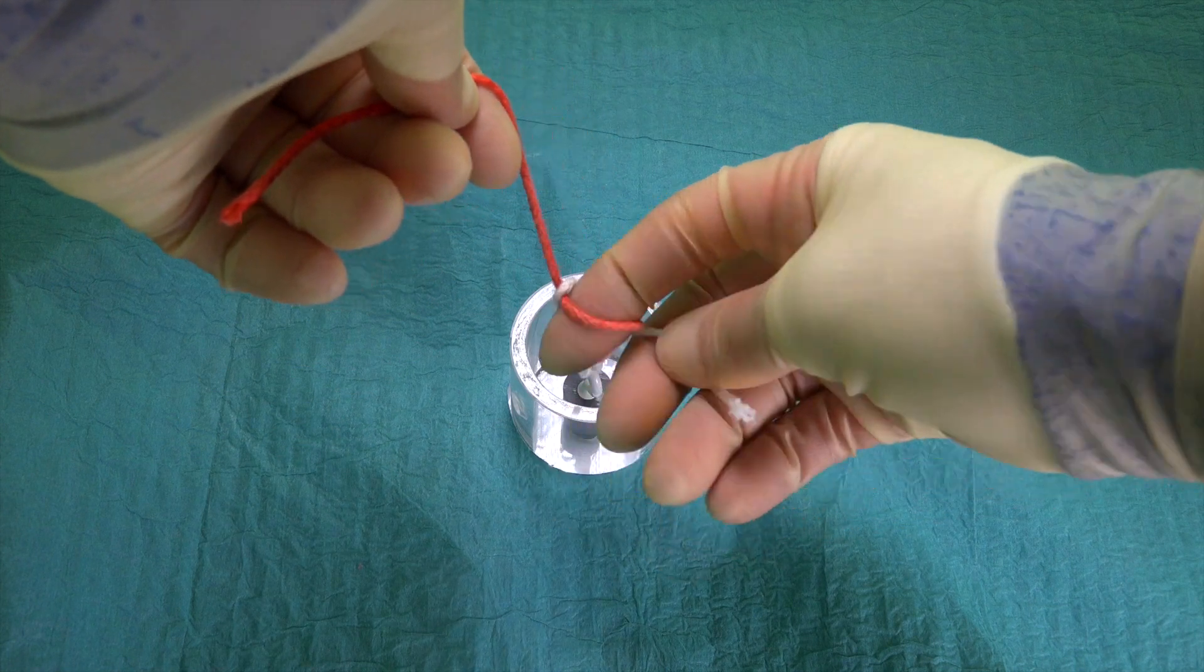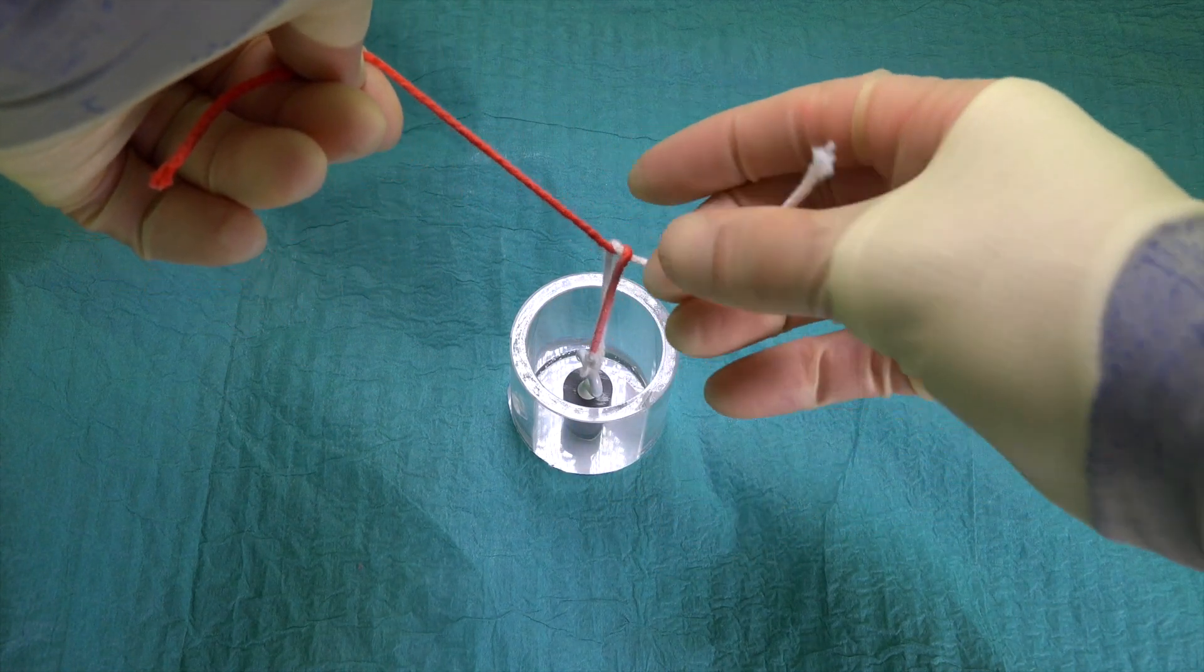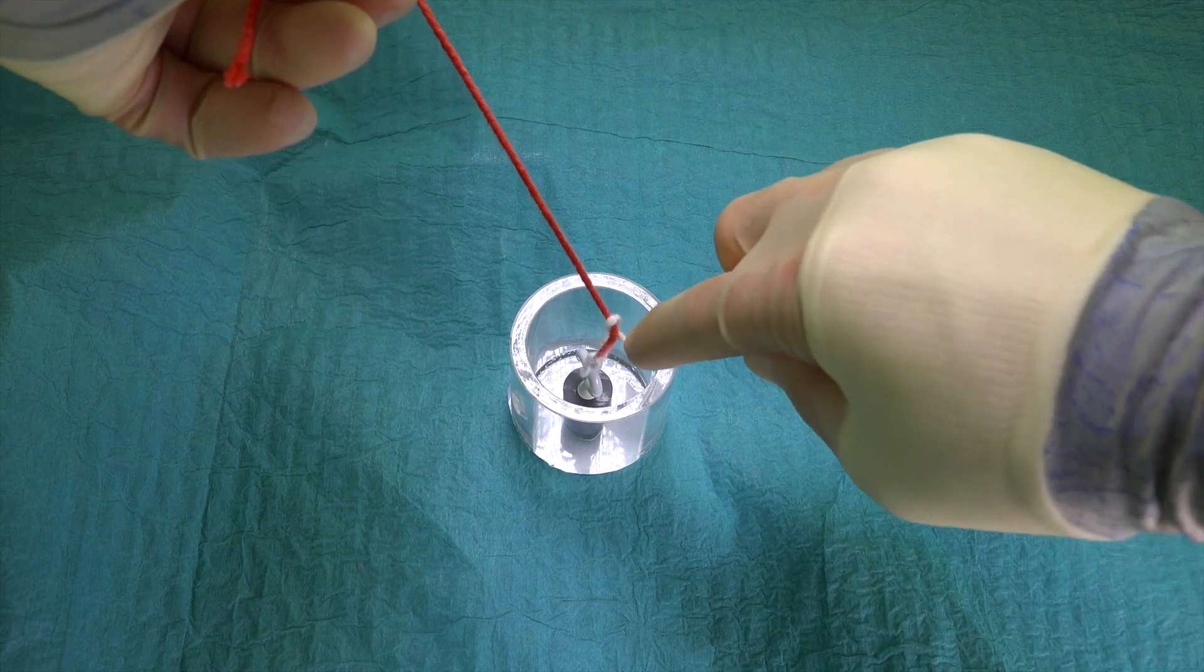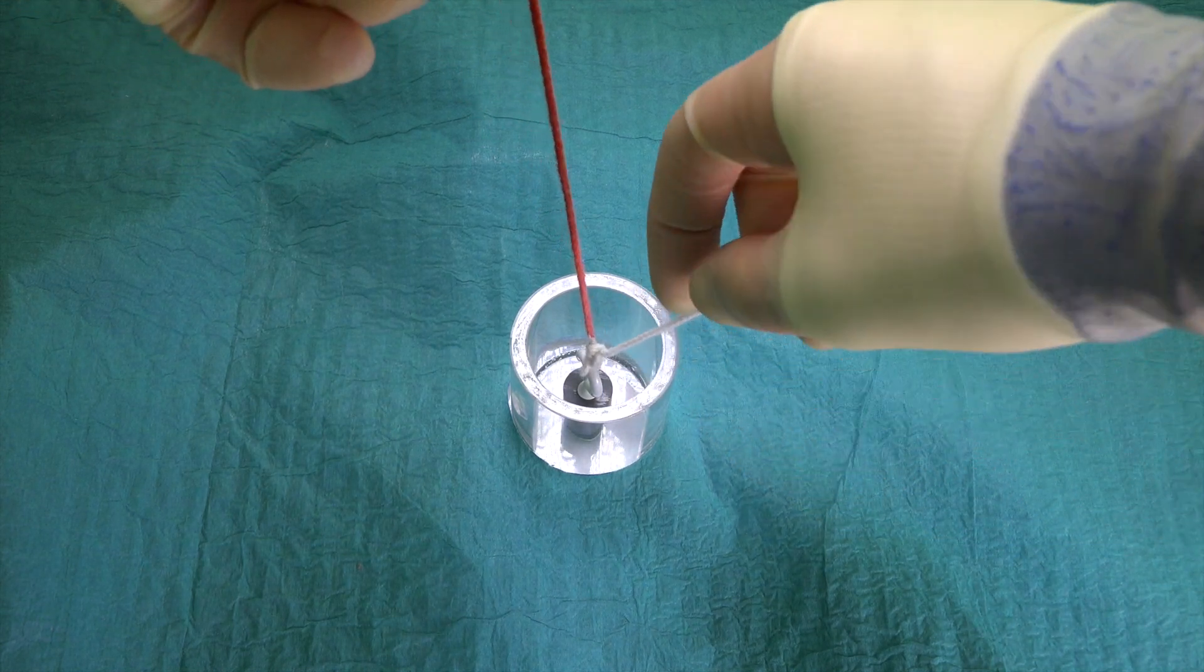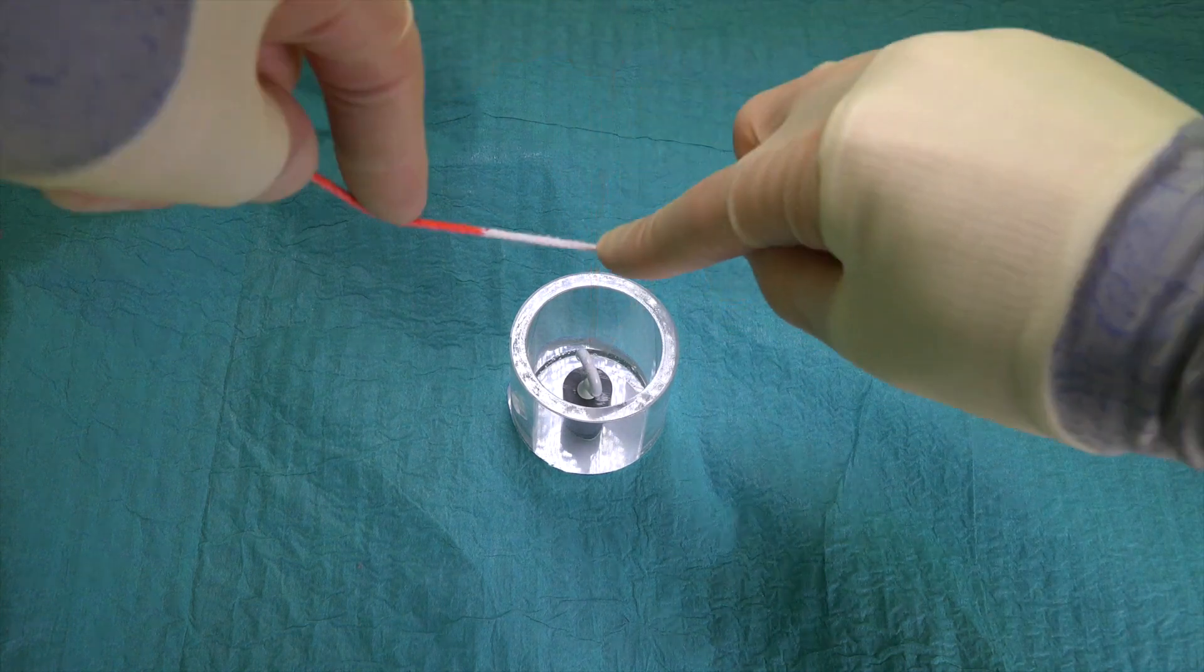Again, we should note that the hands do cross, albeit to a lesser extent than when we perform a normal hand tie. But this crossing of the hands is essential to ensure that we actually form a reef knot and don't accidentally form a slip knot or a granny's knot.